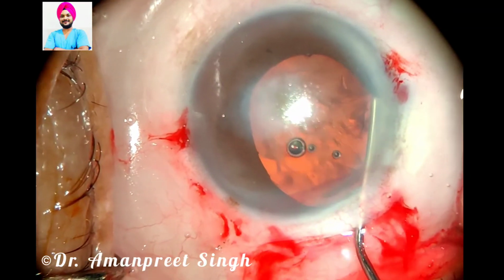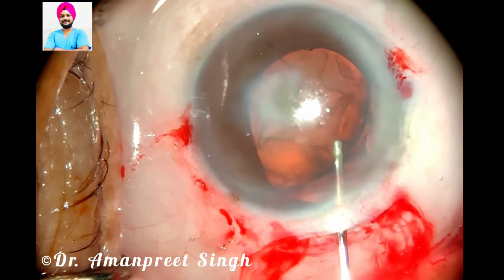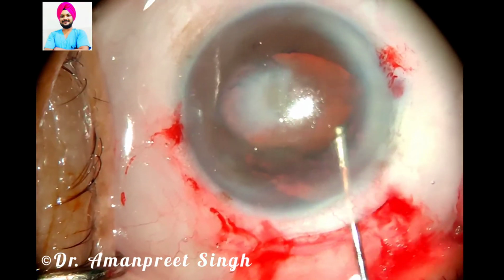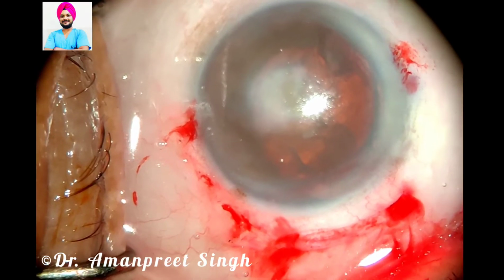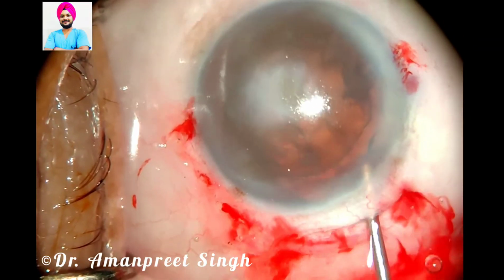Now with the help of balanced salt solution I'm doing hydrodissection, and I have prolapsed half of the nucleus inside the anterior chamber. Now by dialing the nucleus I have brought whole of the cataractous lens inside the anterior chamber. And now it's the time for viscoelastic, maintaining the anterior chamber. I am putting the viscoelastic over and below the cataractous lens.